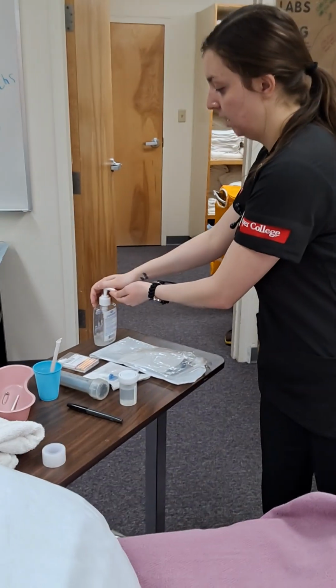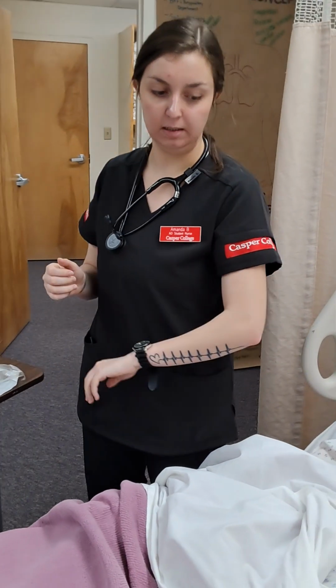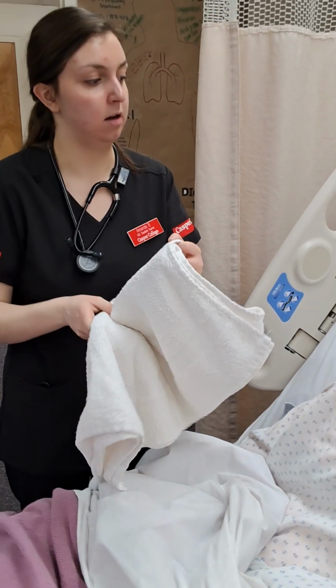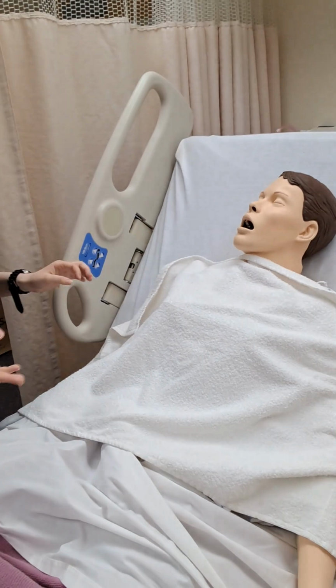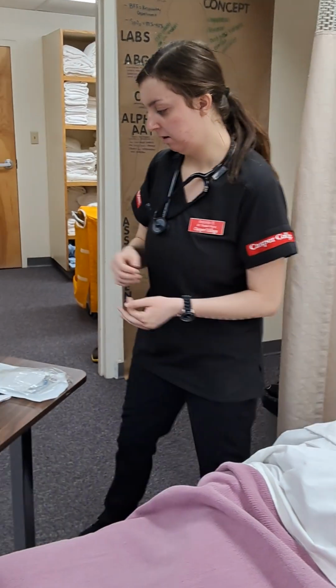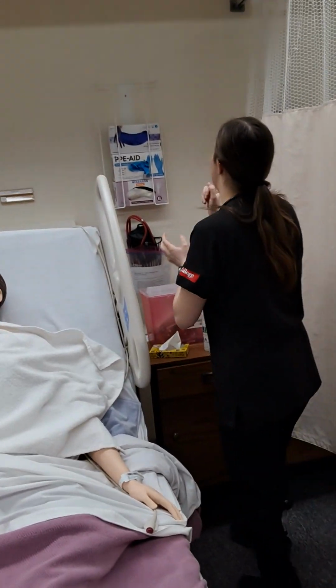Okay, at any time in this procedure, if you feel pain or if you feel uncomfortable, let me know by raising your left hand. If you are gagging or coughing excessively, if you become cyanotic, which is blue, and if you can't talk or hum, I will also stop the procedure. Okay, now I'm going to sanitize my hands and put on some clean gloves.